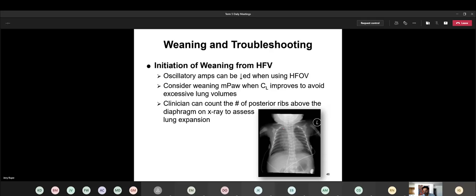So I'm not even going to really try to distinguish between the anterior and posterior because I can kind of see it on the right side, but not really that clear on the left side. So here's 1, 2, 3, 4, 5, 6, 7, 8, 9. And then there's a little bit here I can see. So that will still be considered good because I can count at least 9 ribs. That's rib number 10, 11, and then 12.